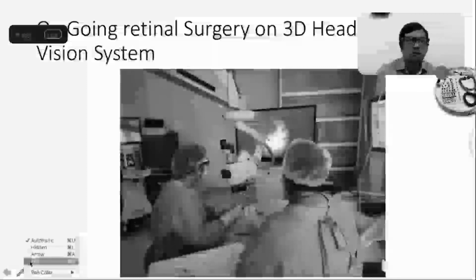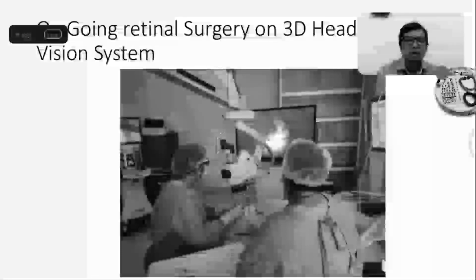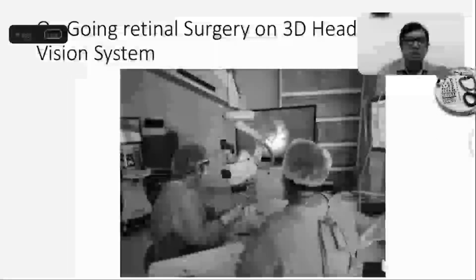You can see here that I'm not using this ocular. It is here, it's not used, and my vision is actually towards the TV here. It's around 6 feet distance. My assistant is sitting here, and my assistant is also having a direct view to the TV monitor. It's a big monitor, and the view is very good actually.